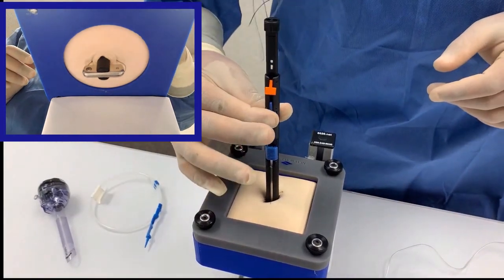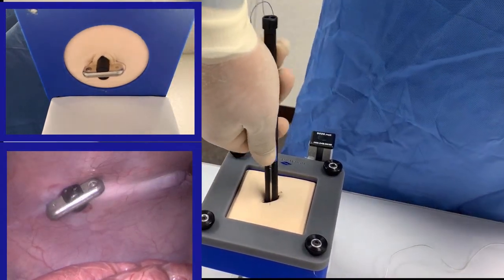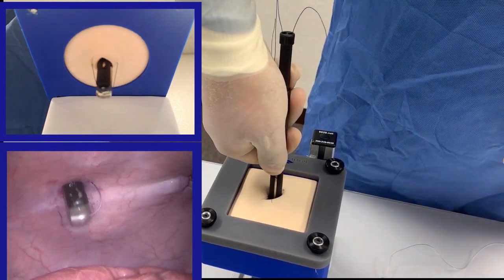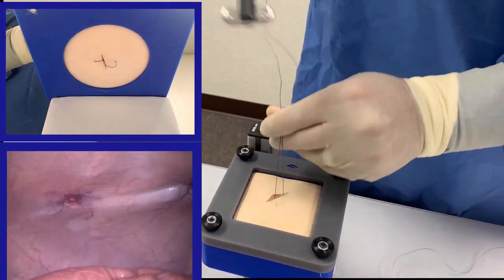Press the needle retract button, push the device in, use the slide button to straighten out the t-bar, and pull the device out.